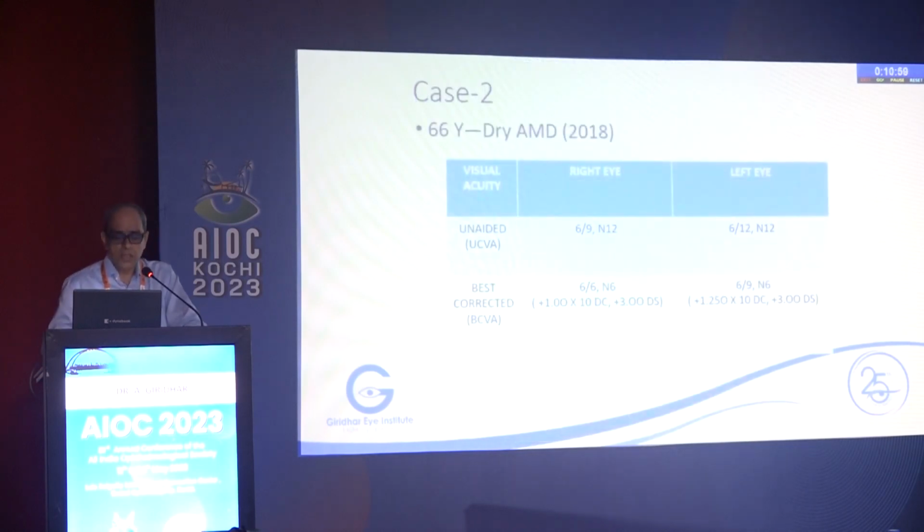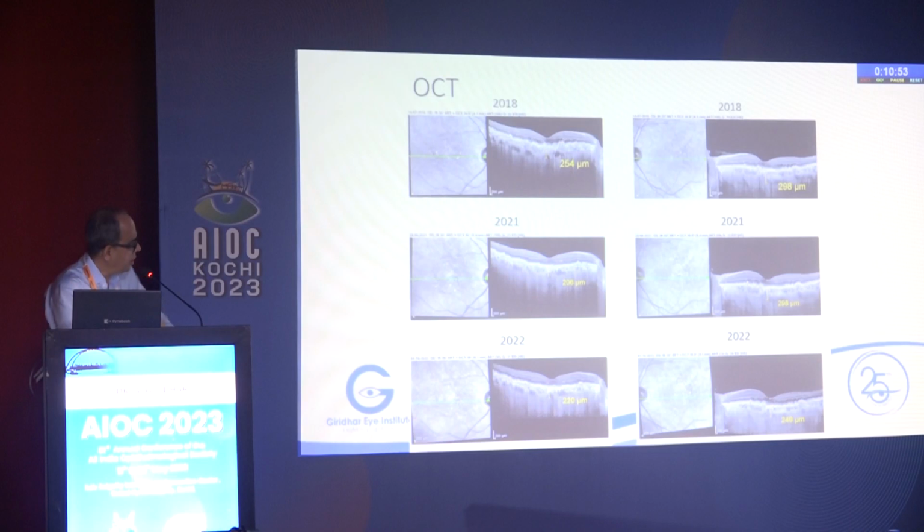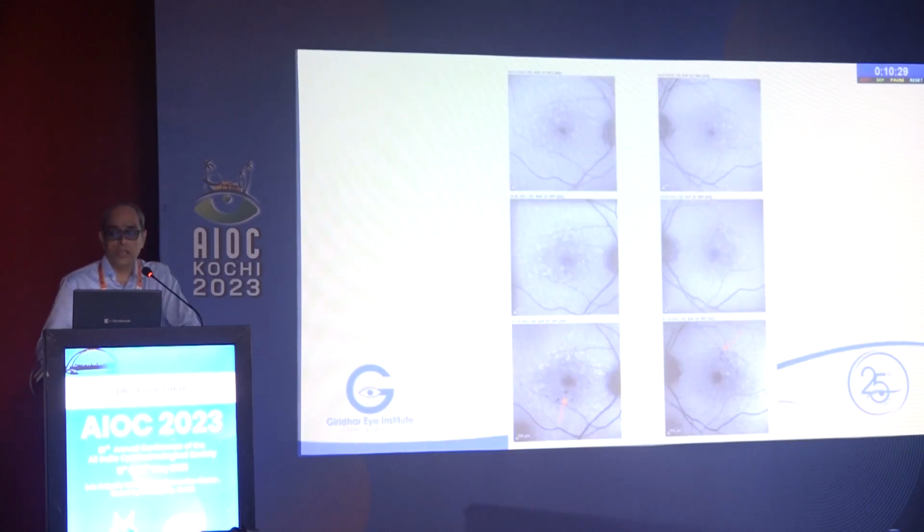Okay. So this is another patient. Now, this is a case I've already written the diagnosis. So good vision, elderly man. Now, what do you see in this OCT here? Dr. Anand Rajendran explained to you a lot of things. Now, based on that, what do you see in this particular OCT? Drusen. So, focal elevations, you must say. See, OCT is interpreted based on OCT language. From OCT, you say focal elevations of the retinal pigment epithelium. So you see drusenoid changes.